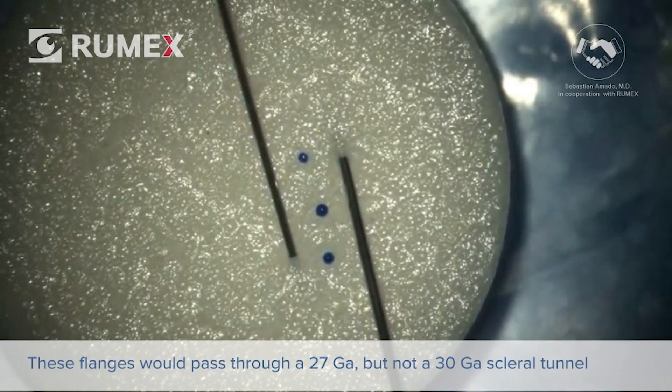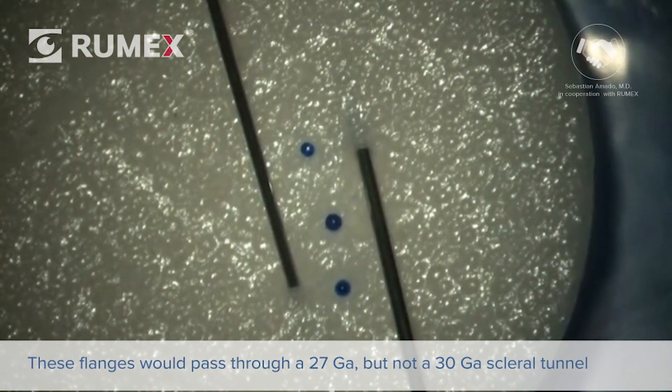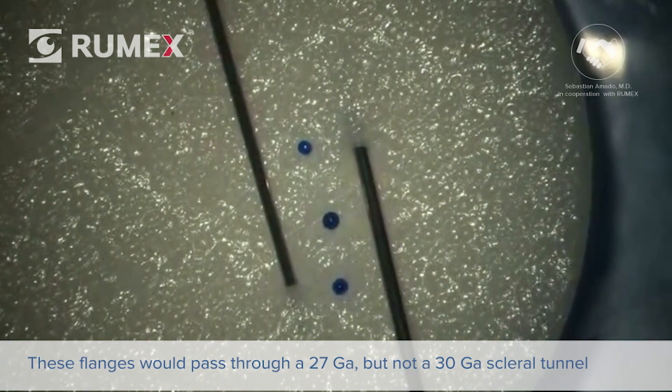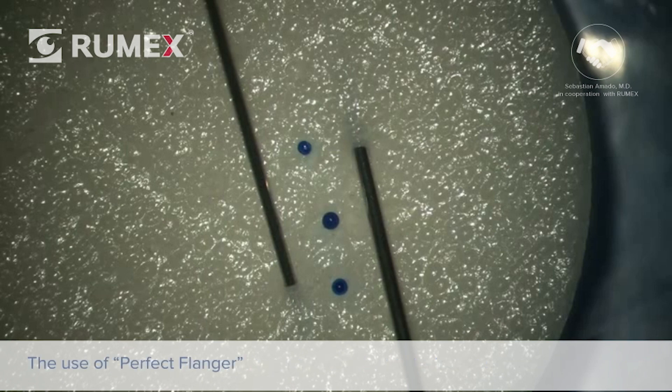Theoretically, none of these flanges would be able to pass through a 30-gauge scleral tunnel, while they might go through a 27-gauge scleral tunnel, demonstrating the advantage of using smaller 30-gauge needles for scleral fixation techniques.